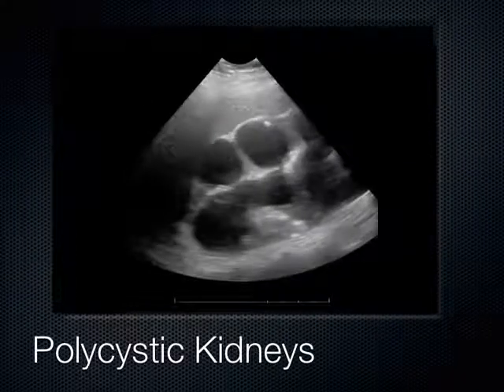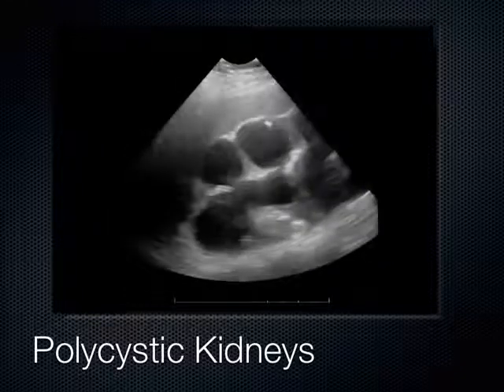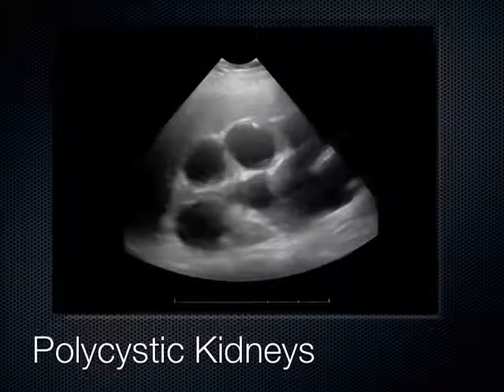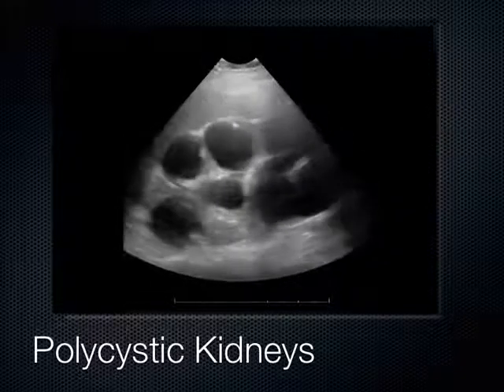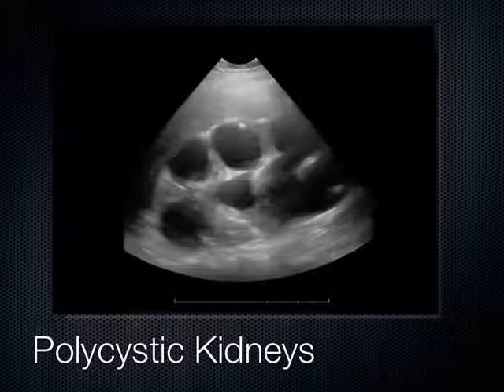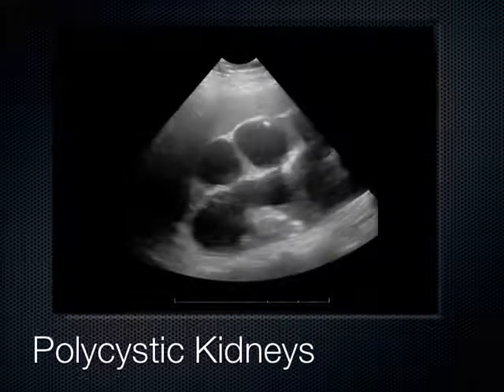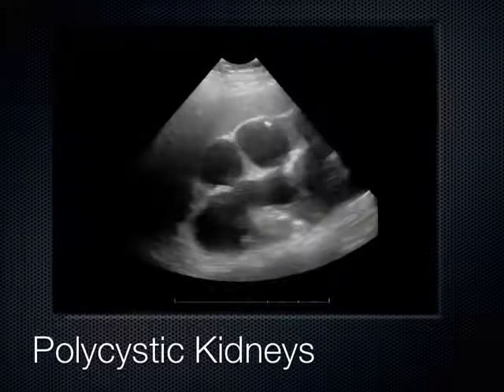You've heard of polycystic kidney disease — this is what it looks like on ultrasound. These are all cysts seen out here in the cortex: this one, this one, this one, this one down here. Polycystic kidney disease is bilateral, and you can see it affect other organs too — sometimes cysts in the spleen, around the liver, and ovaries can look like this with polycystic disease.